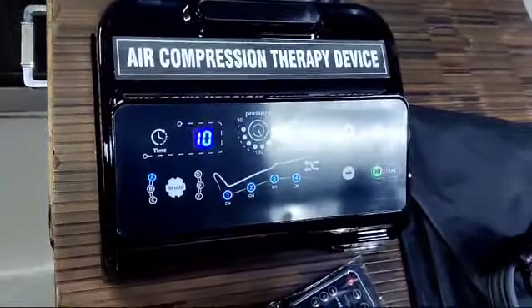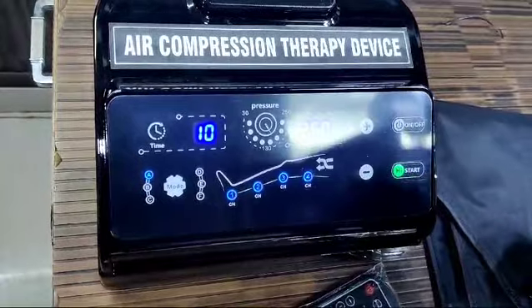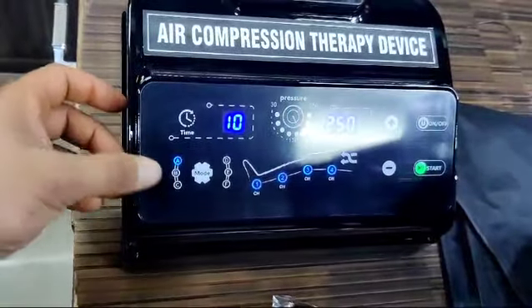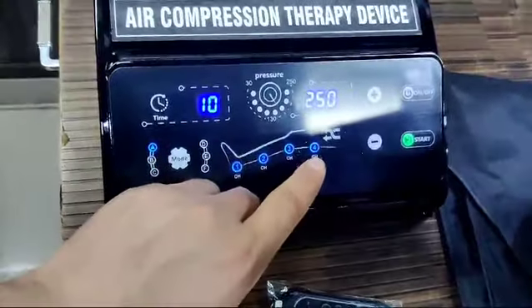This is the Biotronics air compression therapy device, DBT machine, four-chamber digital model, remote controlled as well as touch panel controlled. These are six modes: A, B, C, D, E, F. These are four chambers.